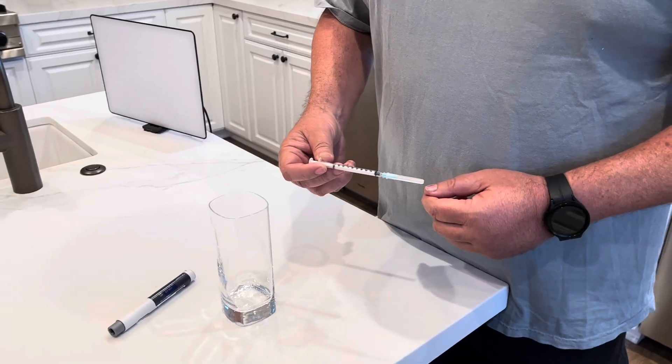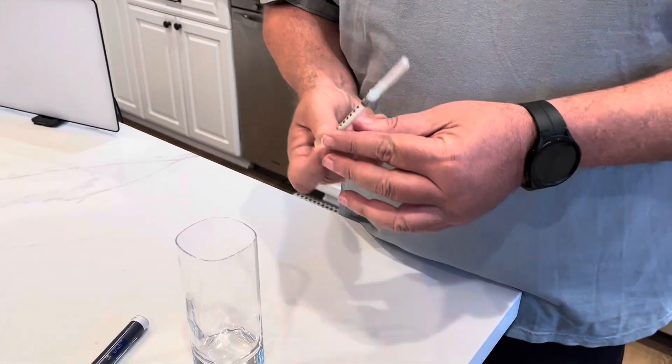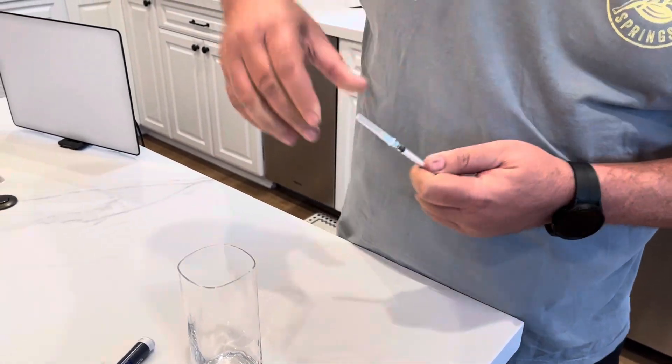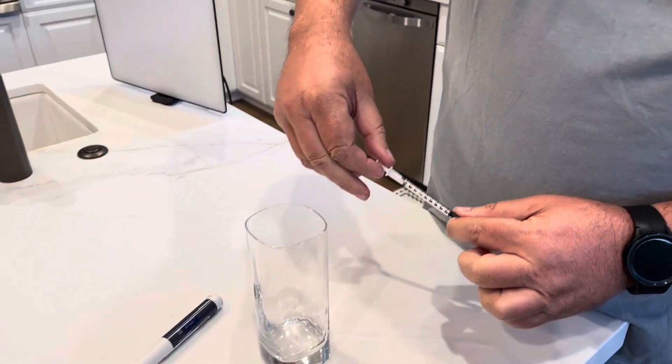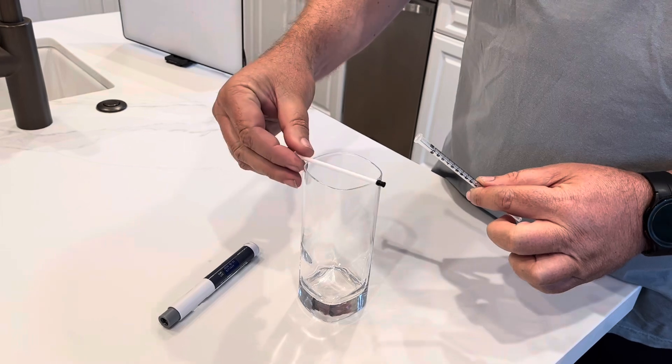The syringe we're going to use as the intermediate vessel — the first step is to make sure this needle is secure. This is a slip tip, so you need to press it on really tight because they tend to come off easy. Now that we know the needle is nice and secure, we're going to remove the plunger and place it somewhere clean, like let it overhang the lid of this glass.